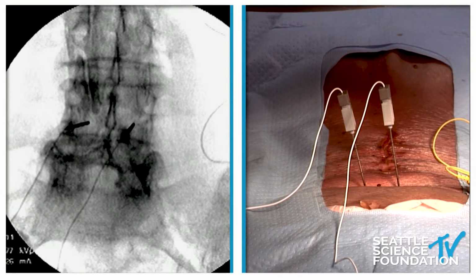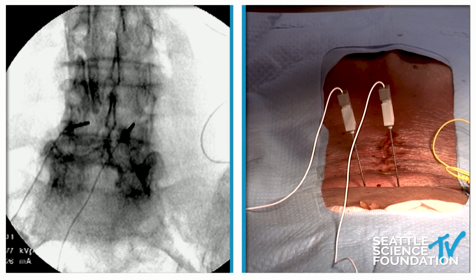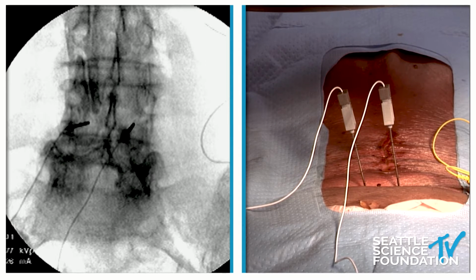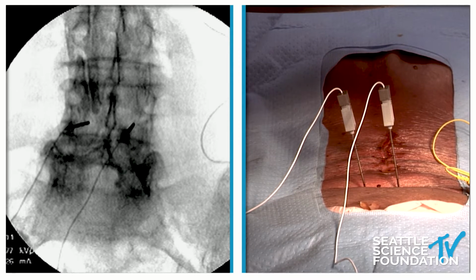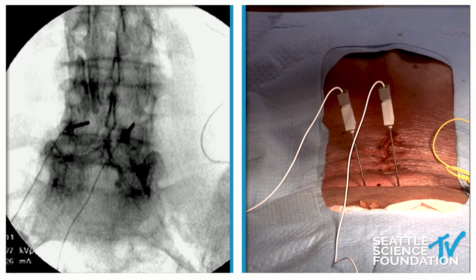And the answer to that is because the field of stimulation is basically a 5 to 10 millimeter radius from the tip of the lead, you don't want unnecessary stimulation of the nerve root. So that technique is not going to be best suited for this particular therapy. Whereas if we place the lead at this location on the lamina, there is some guarding that occurs where we're really only getting the posterior nerves, and we're not at risk of getting the nerve root, i.e. causing a motor paresthesia or a sensory paresthesia, dysesthesia going down the leg, for example.